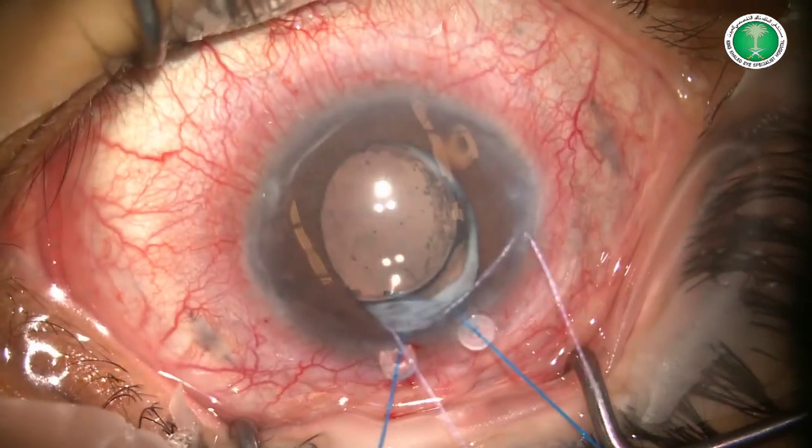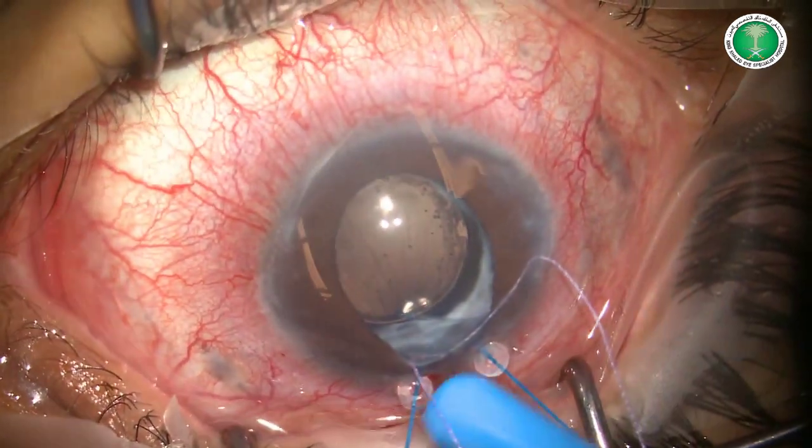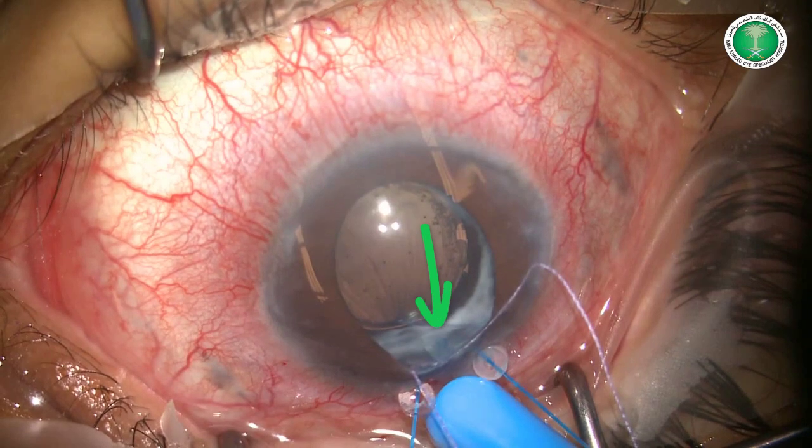The globe is retracted superiorly and with gentle pressure on the sclera, we can easily visualise the tip of the tube.